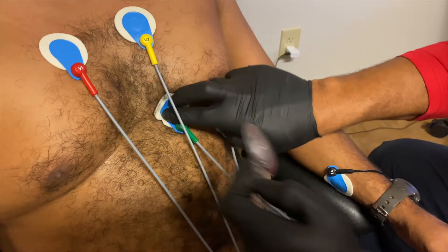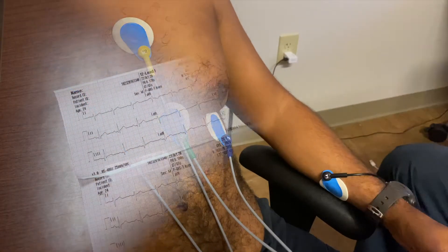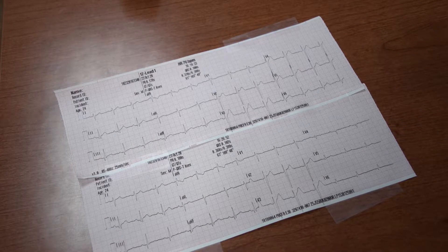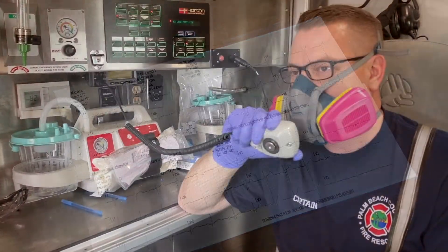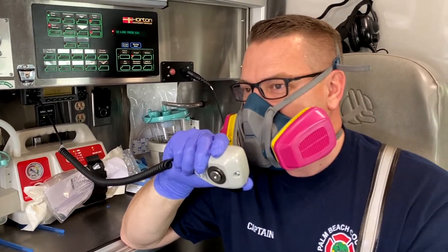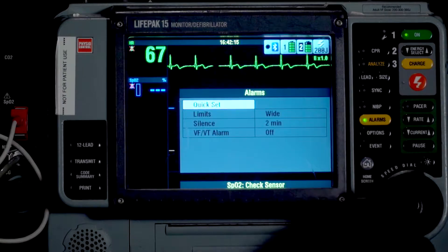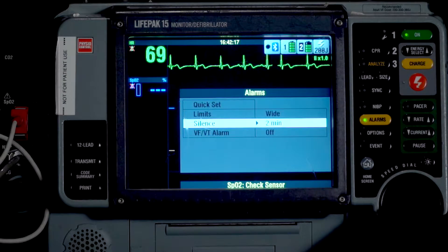Today we're going to review EKGs with a focus on STEMIs. This video is designed to be a tutorial for obtaining both a 12 and a 15 lead EKG, calling the STEMI alert, transmitting the EKG to the hospital, and setting the VF/VT alarm. However, we're going to simplify this into something easy to remember.